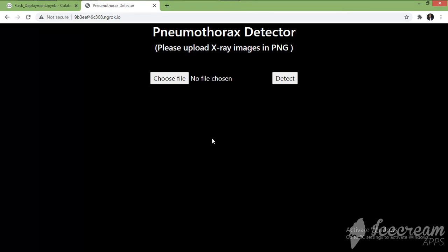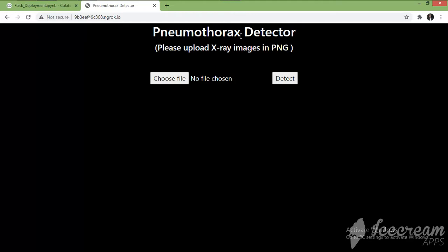Hello everyone, welcome to this video. In this video I am going to showcase a working demo for a deep learning model that I have trained using chest X-ray images. The basic aim of this model is to detect pneumothorax, a disease which occurs in the human lung.